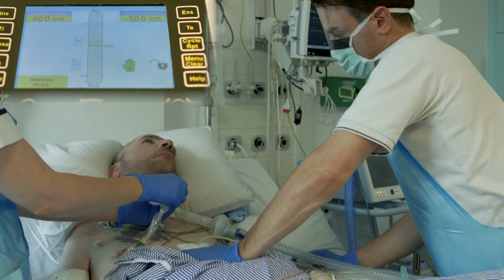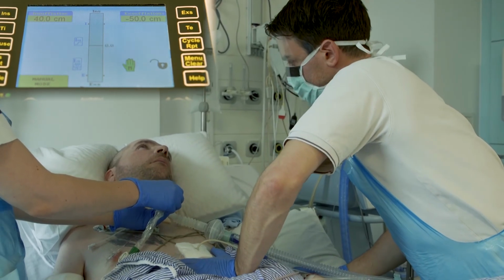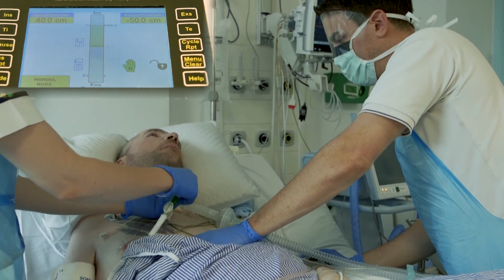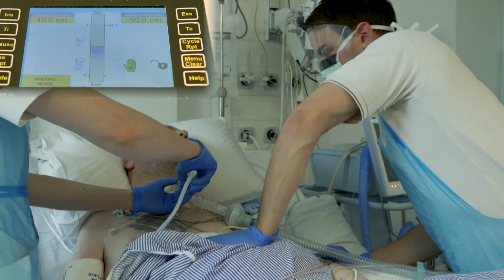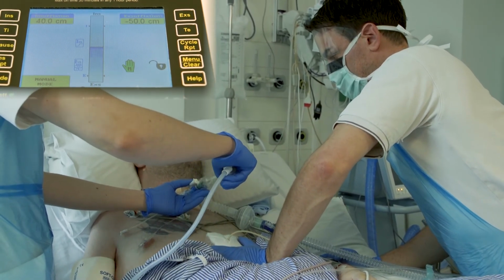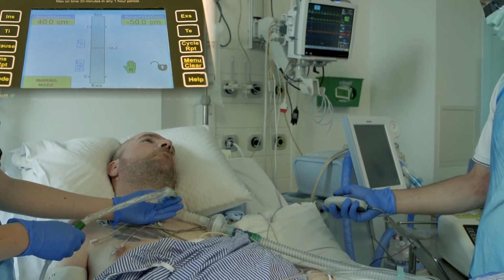Additionally, you can see that the second physio is passing down the suction catheter through the trachea so that the tip is placed in the carina by the time the exsufflation is applied, allowing the suction, exsufflation and manually assisted cough to be performed simultaneously. Following suction, 2 recovery breaths were performed by the therapist.